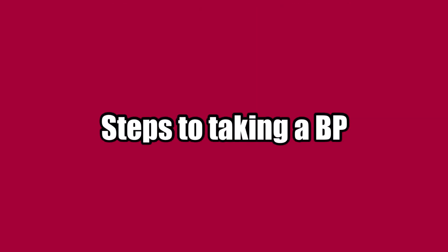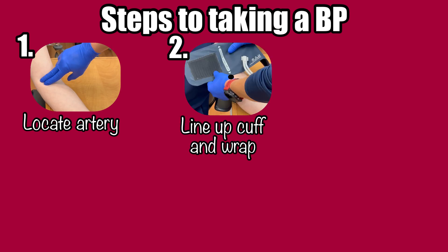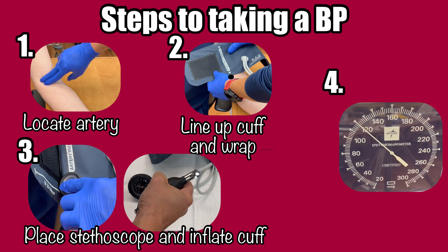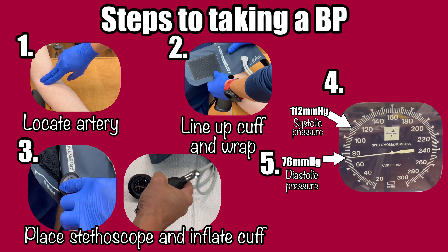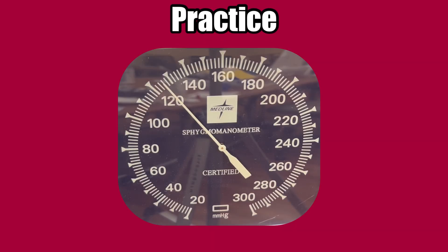Now that we have a full understanding of what we're measuring, let's recap the steps. 1: Locate the brachial artery. 2: Line up the artery marker on the cuff with the artery, and wrap the cuff around the arm snugly. 3: Place your stethoscope over the artery, and inflate the cuff until you cannot hear the pulse. 4: Slowly deflate the cuff 2 millimeters per heartbeat — note the number when you hear the first thump as your systolic pressure. 5: Continue to slowly deflate, and note the number when you hear the last thump as your diastolic pressure. 6: Completely deflate the cuff and remove it from the patient.